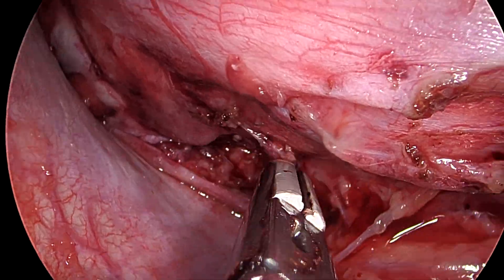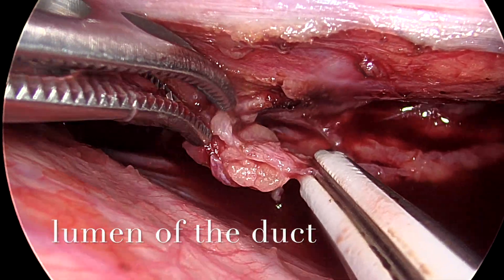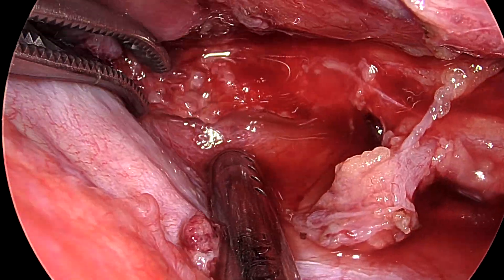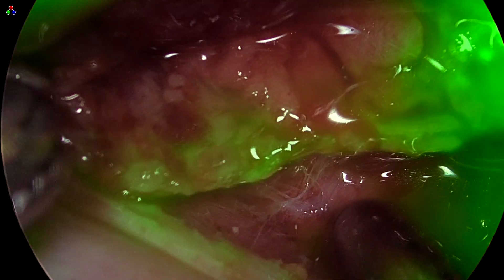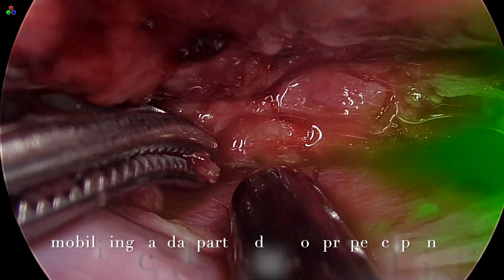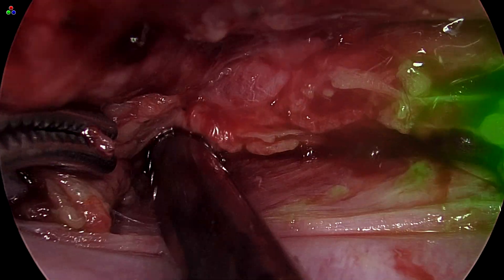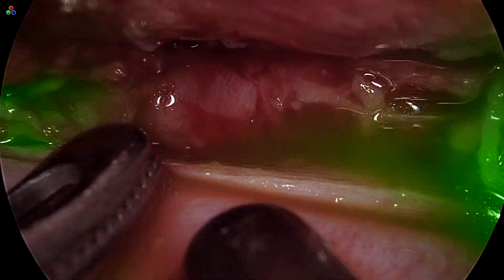The caudal portion is being dissected such that it can be clipped. We can see the lumen of the thoracic duct here. The caudal part of the thoracic duct will now be mobilized so that adequate clipping or suturing can be carried out. Blunt trauma with chylothorax is a relatively uncommon presentation, the mechanism of injury being hyperextension leading to shearing of the thoracic duct.